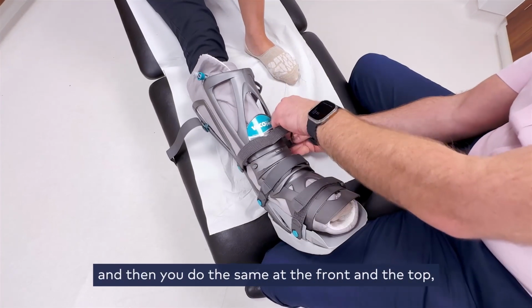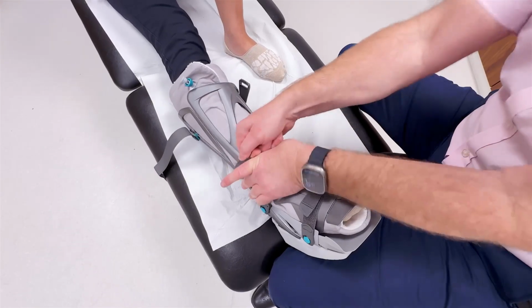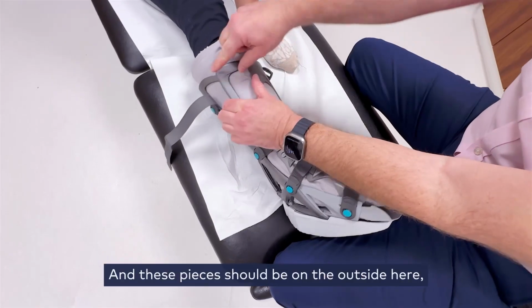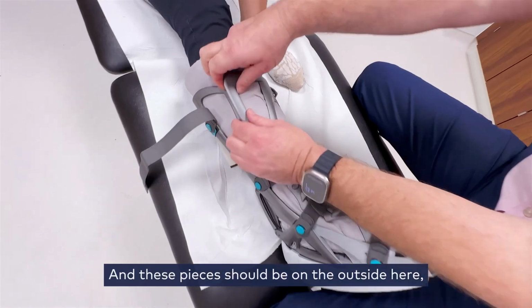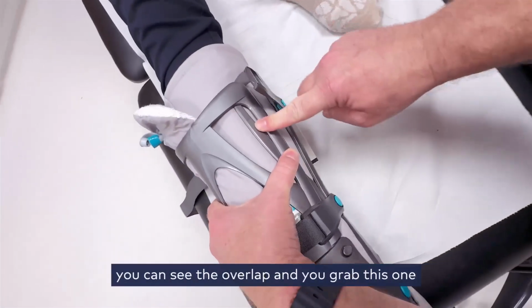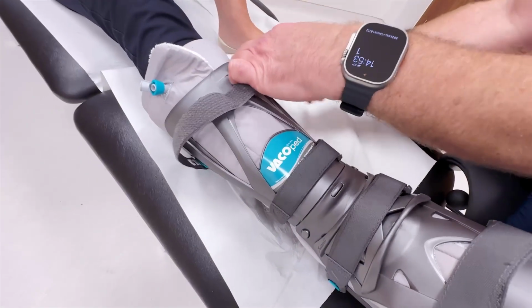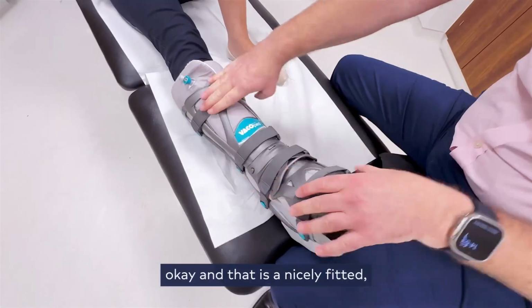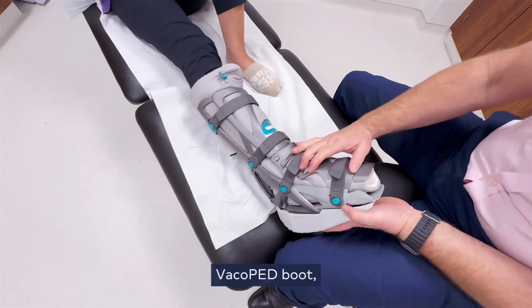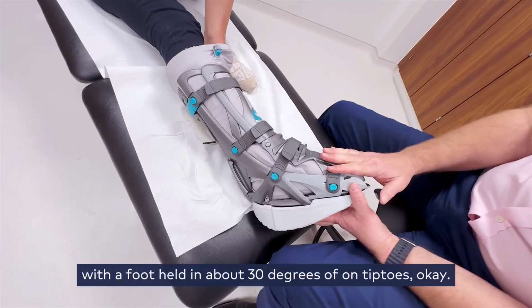And then you do the same at the front and the top, just like a ski boot. And these pieces should be on the outside here. So on the outside there, the front pieces are on the outside. You can see they overlap. And you grab this one. Okay, and that is a nicely fitted VacoPED boot with the foot held in about 30 degrees on tiptoes.